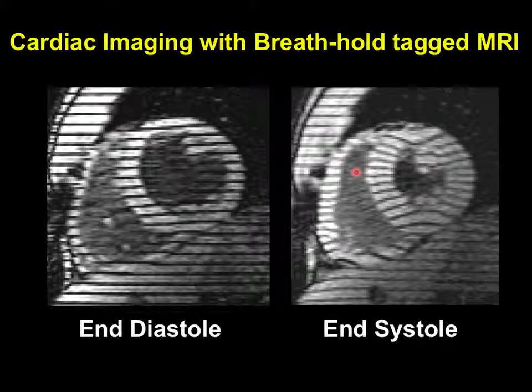So if their EKG is highly non-consistent, then you will have funny relaxation things happening with the magnetization, and it'll vary its height, but the actual volume of blood contained in the heart beat to beat will change. Because if you have a long R to R, you have more time for the ventricle to expand and fill. And so you get a full ventricle after a long R to R. And then if you have a quick beat, you have a non-filled ventricle. And so the actual geometry of the ventricle is different for different R to R values.